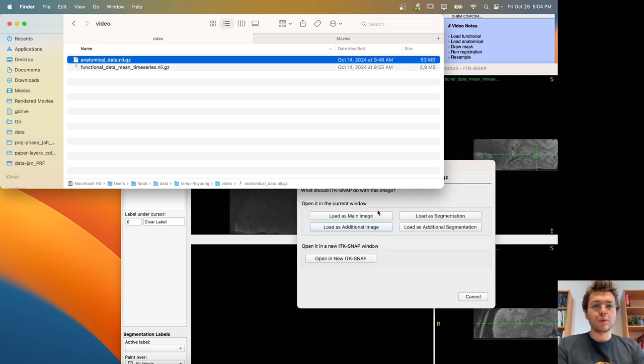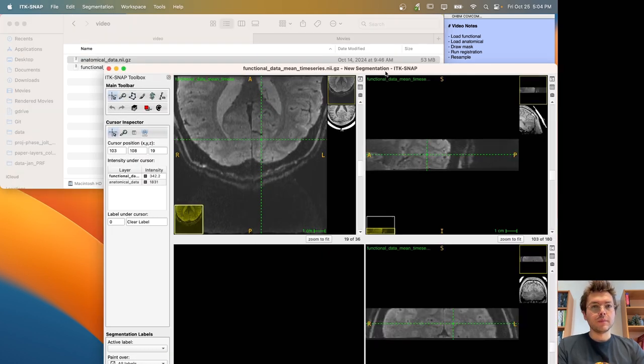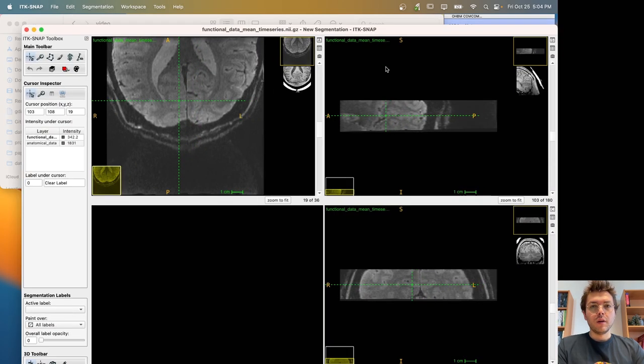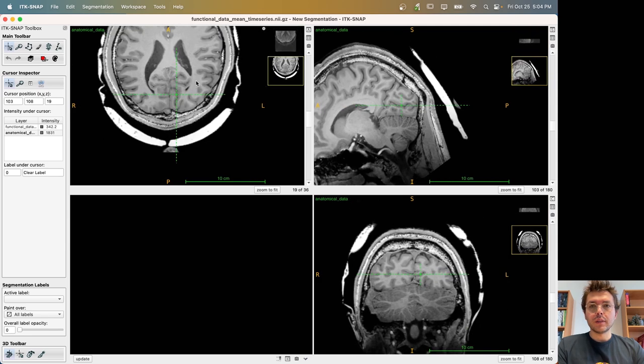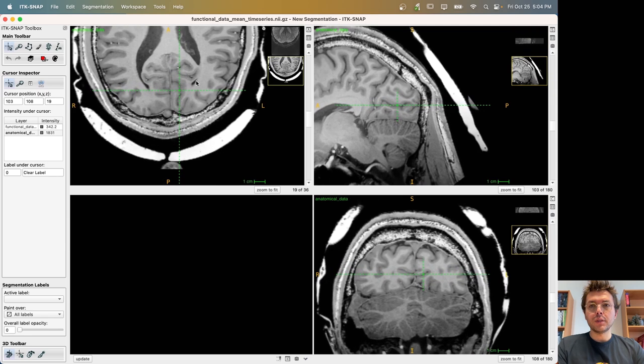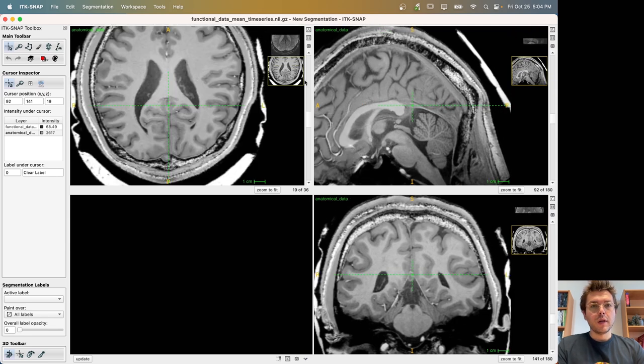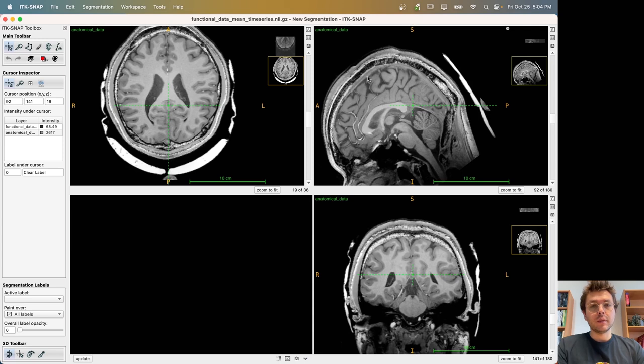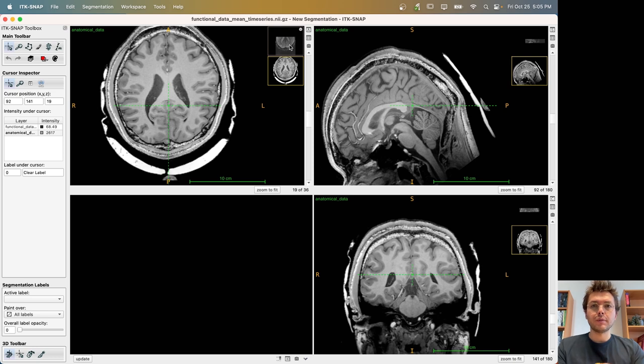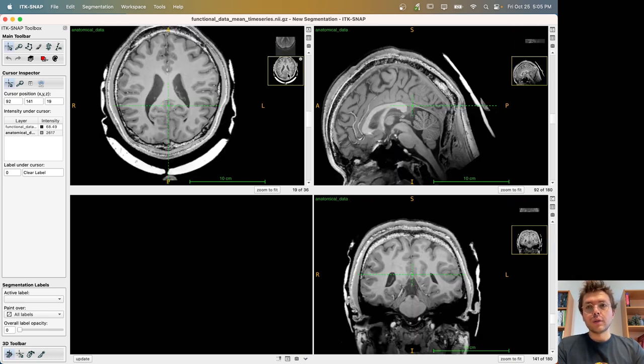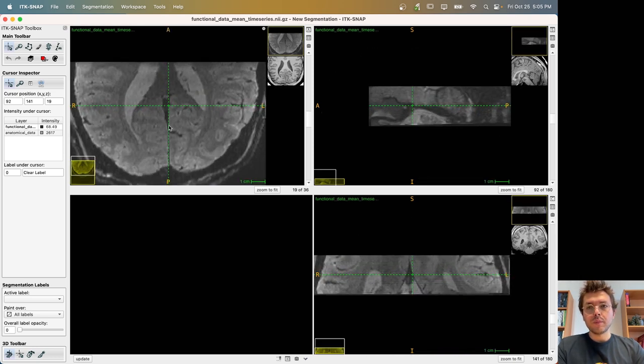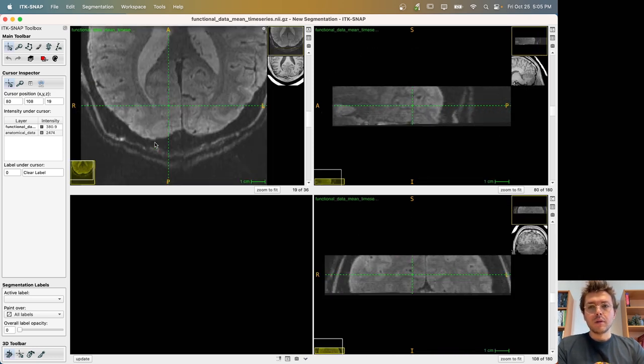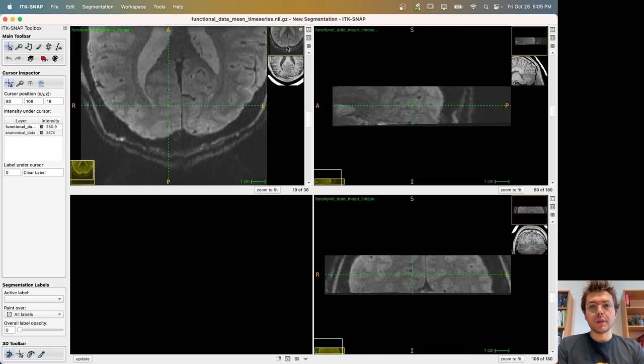Now we are going to put the anatomical image on top of it. You can see that this is an MP2RAGE UNI image, and this is whole brain data, and nicely, because these NIFTIs are created correctly and pre-processed correctly, as far as I can tell, there is already a good overlap between the fMRI slab and the anatomical data.